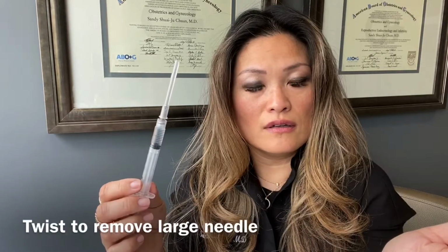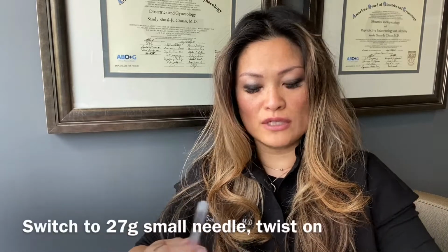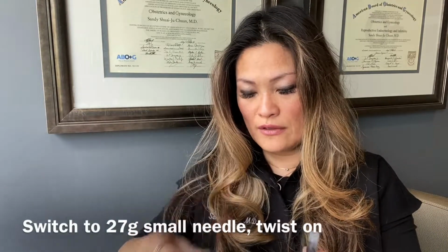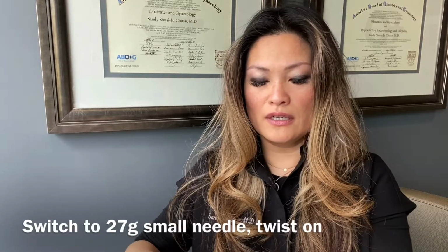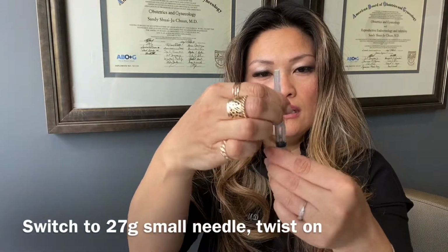A lot of times I'll have people just put the cap on the table and then put the needle in to just try to hook it on first and then cap it. And I can show you that a little bit later, how I do that. But if this is all the dose that you need, then you would be switching your needle at this point. Your syringe will allow that needle to be twisted off, and then you want to keep the syringe upright, and you take your smaller needle and just twist it on.